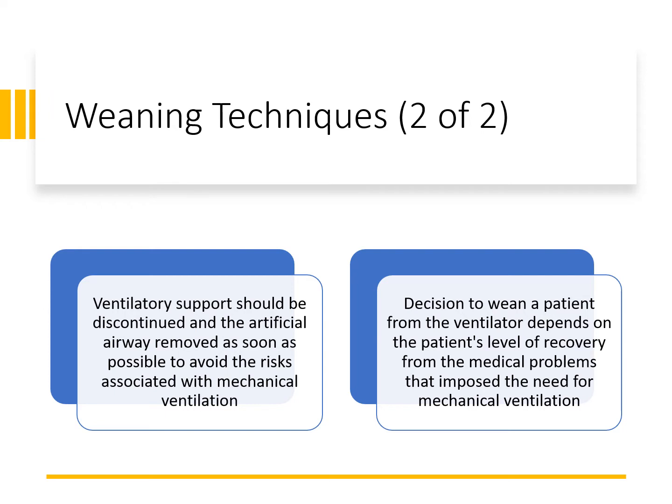Other times, patients require therapeutic interventions. When we're intubating, sometimes that's a big part of getting patients through different therapeutic procedures like surgical procedures or even surfactant replacement therapy with babies. So those first three things that we talked about can be treated separately. They are a big part of the overall process of weaning.